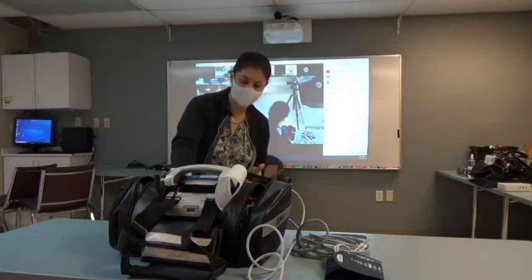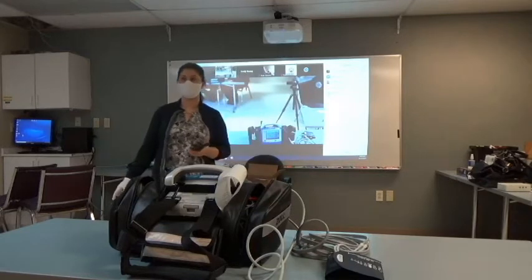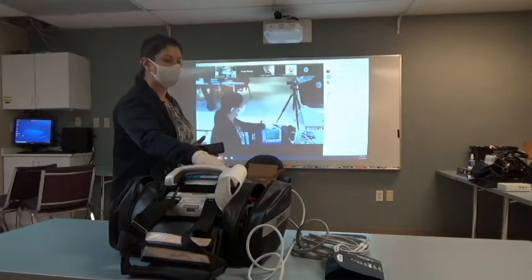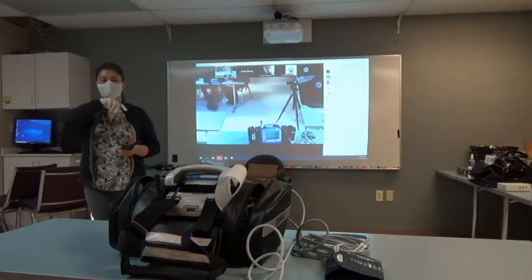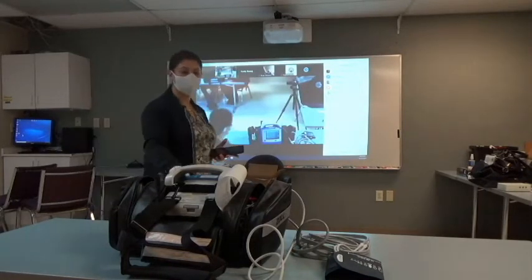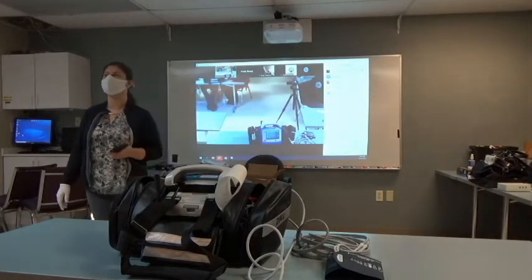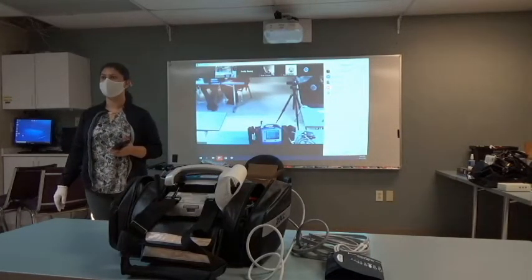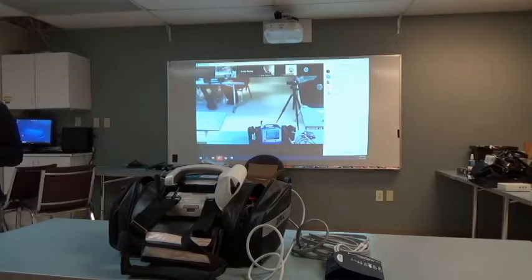Press enter. You should be getting a green light on the top of your monitor, letting you know that you're moving data. When it's done, you're going to get a confirmation that says 12 lead transmission complete in green. Now we're going to move over to this side. I can tell you my email's definitely there because my email just exploded. Yes.